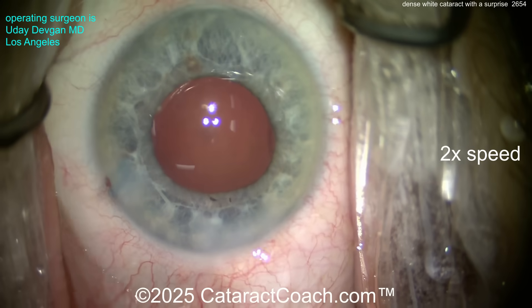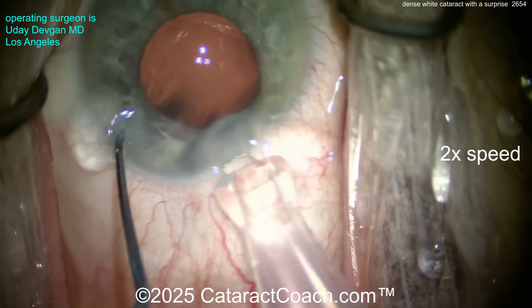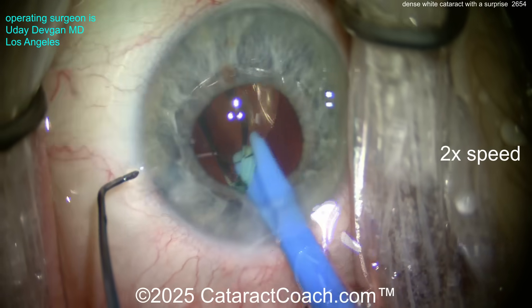Cohesive viscoelastic going inside the eye, filling up the capsular bag. Let's get the lens in — single-piece acrylic lens. This patient wants a little bit of a myopic target, aiming for maybe minus one-ish. Get that lens in the bag.